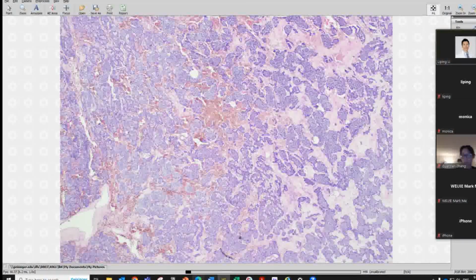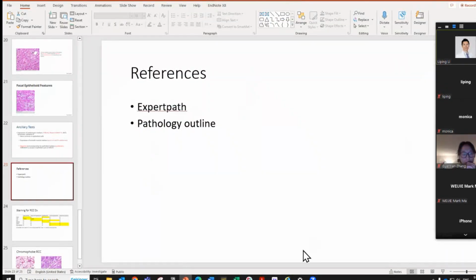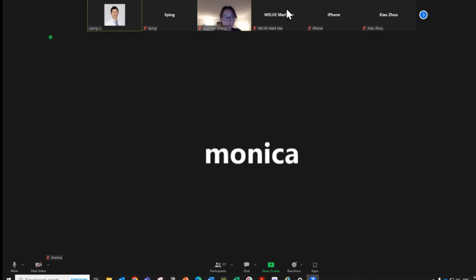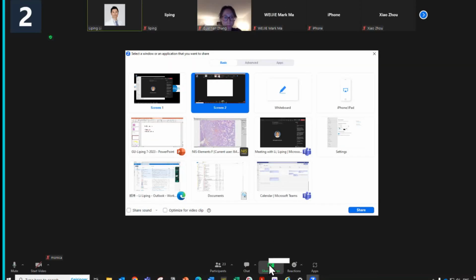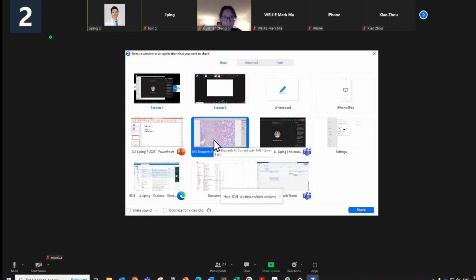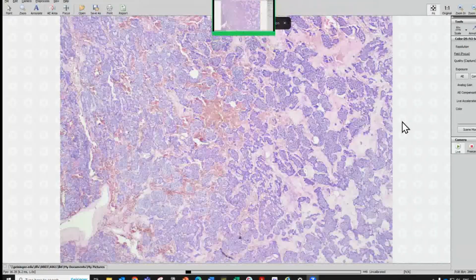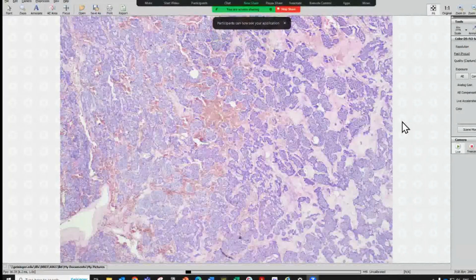Let's stop sharing my PPT. Could you see this screen, the glass slide? Good. So let's get started.